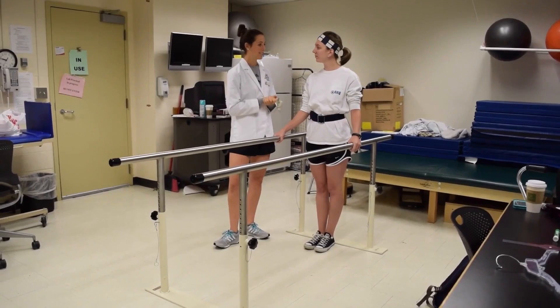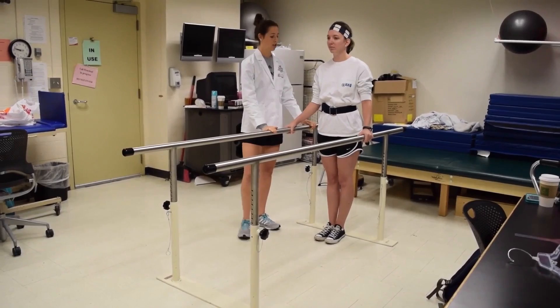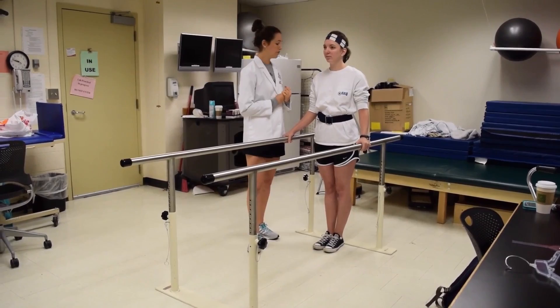With our parallel bars today, before we do any gait pattern activities, we're going to start with the proper fit for a patient. That's very important to begin with. We have three key points to go over.